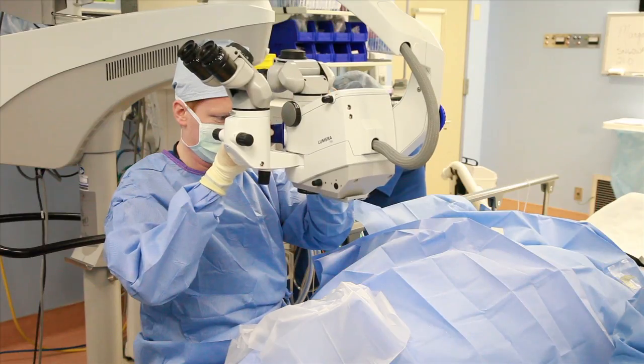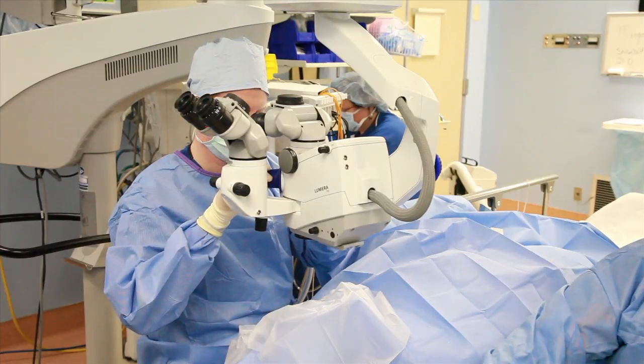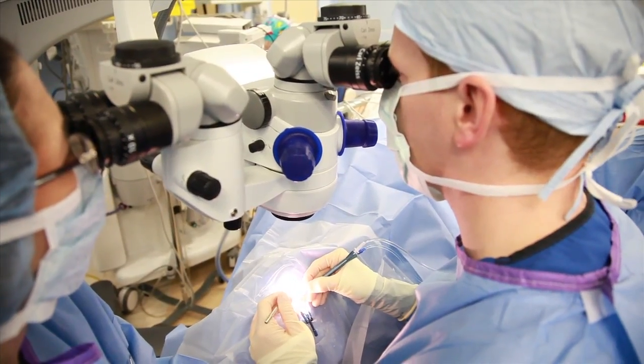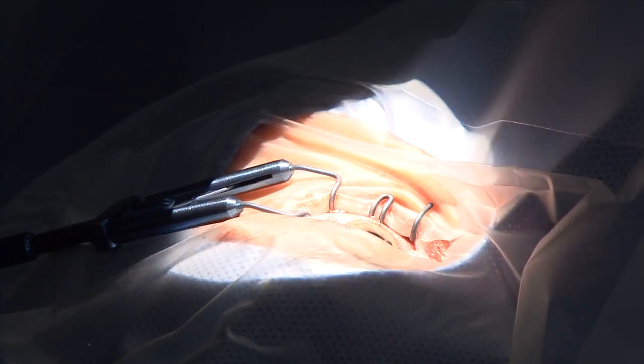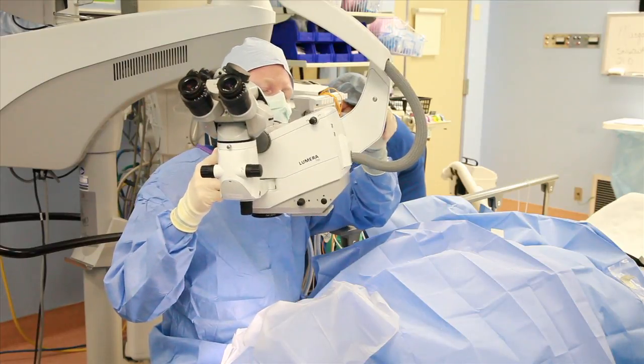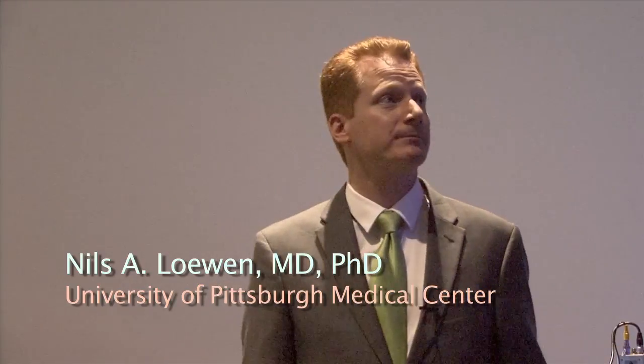The first and important thing, I think, for you as a beginner is get a great microscope for your first case. If you have access to a Lumera, for instance, with nice xenon light that gives you a good color contrast, that is what you want to use for that. Or any good microscope that has also a good tilt. If you start out with an average scope that has sort of a shift tilt, where the thing plops towards you, that you cannot adjust gradually, or any microscope with terrible optics, don't use it.